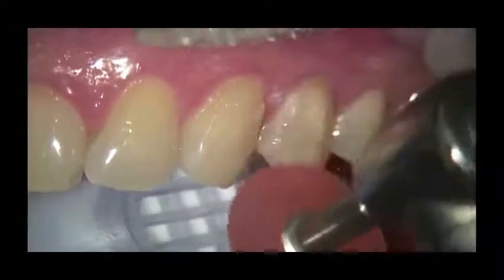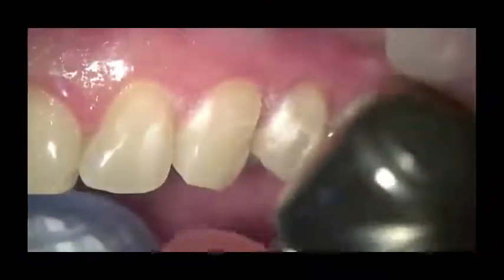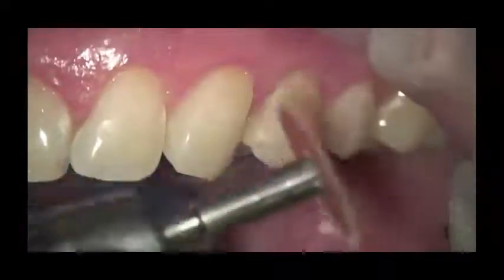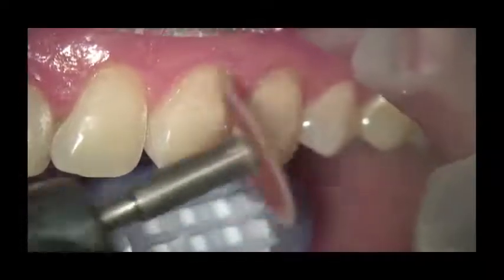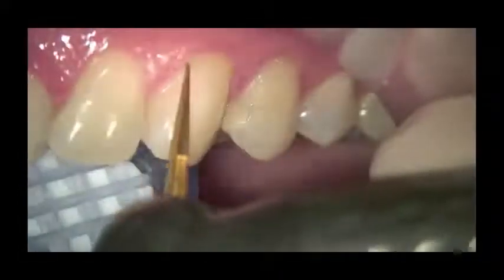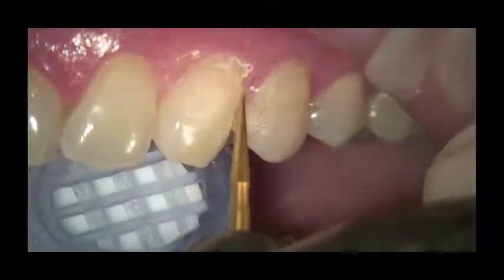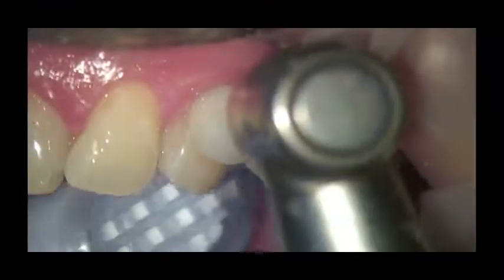You can see it works really nicely. We're just going to quickly contour the restorations. And then we'll follow this up with a fine carbide burr. And I'll either use a carbide burr or a fine diamond. Personally, I prefer carbides for these kind of restorations.